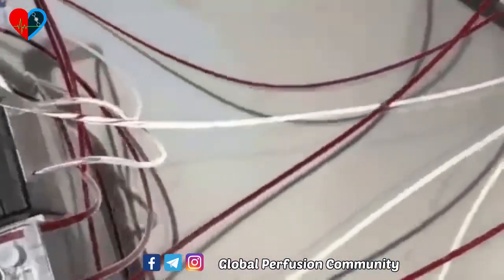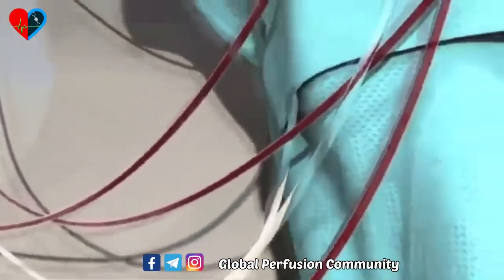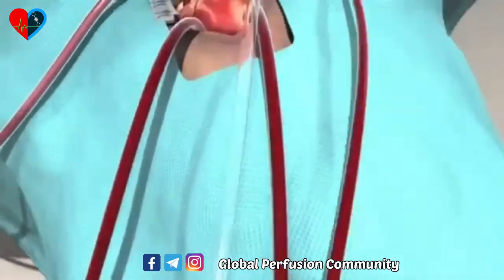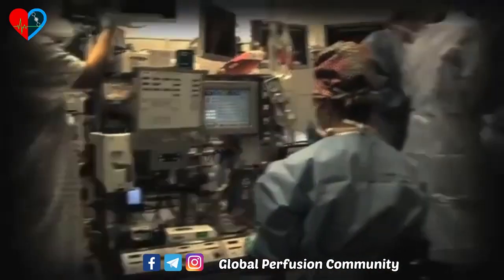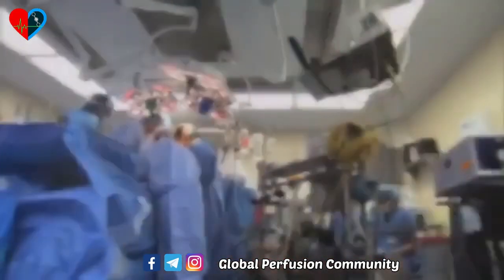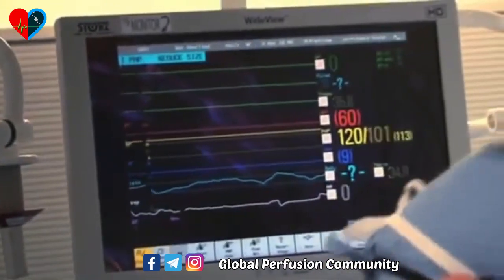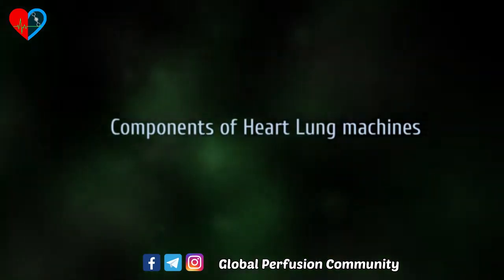The machine also removes carbon dioxide and other waste products from the blood and delivers anesthesia and medications into the recirculated blood. In some cases it cools the blood — cool blood lowers the body's temperature, which helps to further protect the brain and other vital organs during surgery.